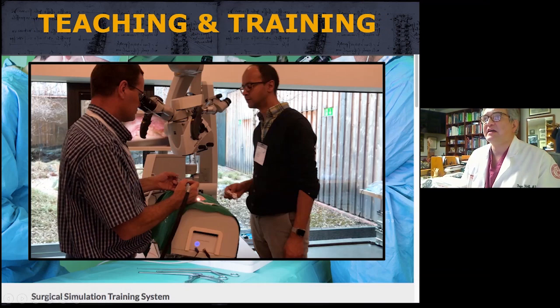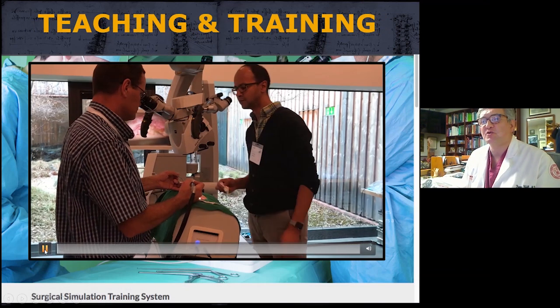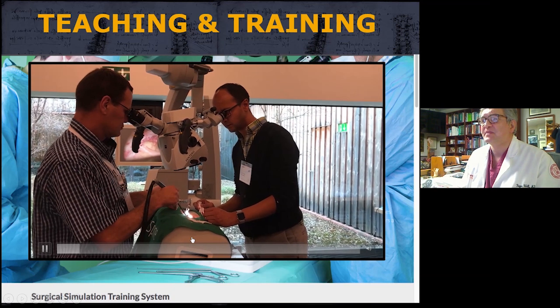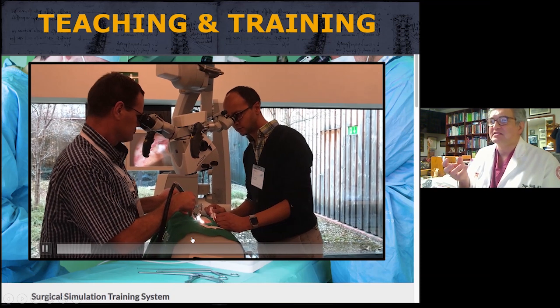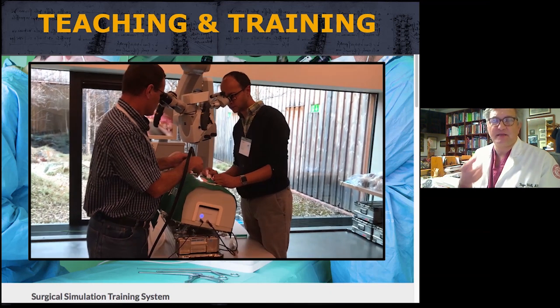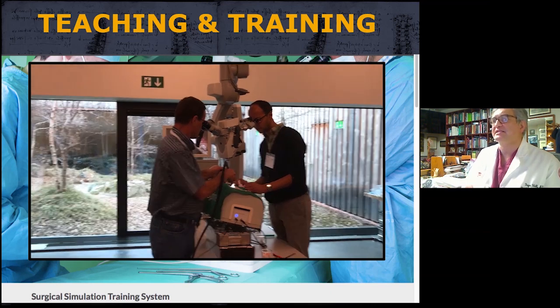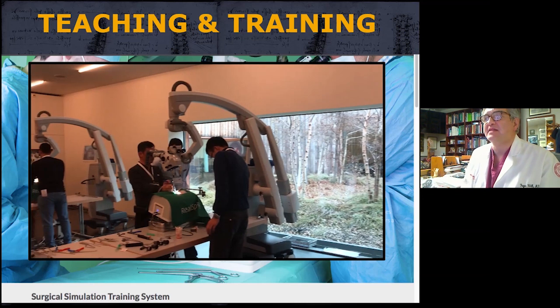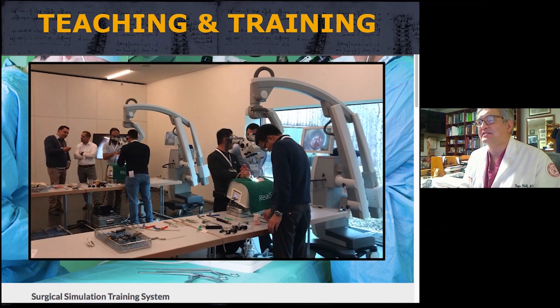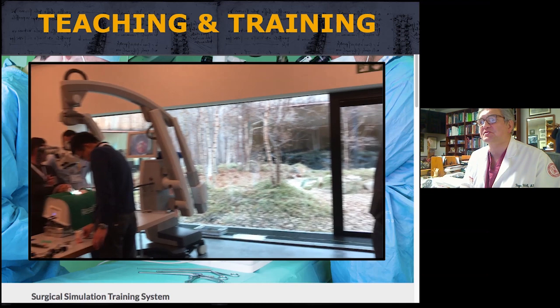Now, some of you have been to Davos, to the AO courses, and we've done training courses there using these synthetic spine models that replicate some of the typical pathology that we see, lumbar spinal stenosis, spondylolisthesis. And I think there was a recent course in Dubai where a lot of your colleagues and yourself maybe had an opportunity to try this out.